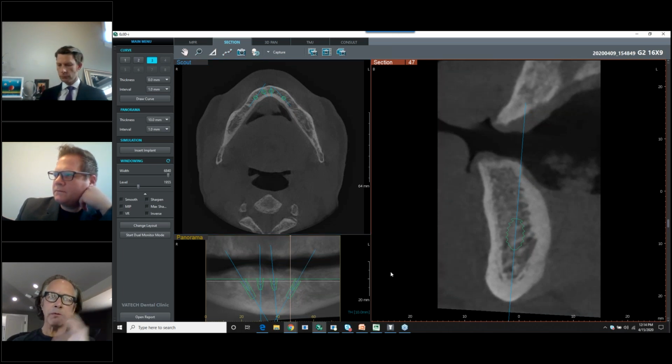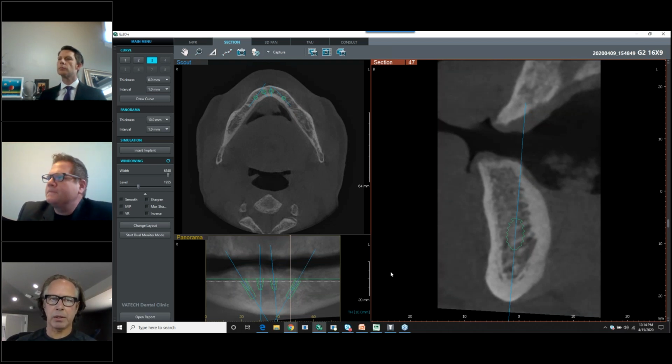All of my courses, guys, are agnostic courses. By that, I mean I teach you how to do it with anything. You don't have to have Vatech, and you don't have to have any other cone beam manufacturer. It is about learning how to do guided surgery with a set of DICOM files.